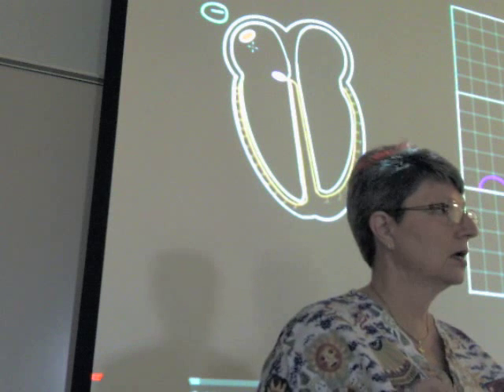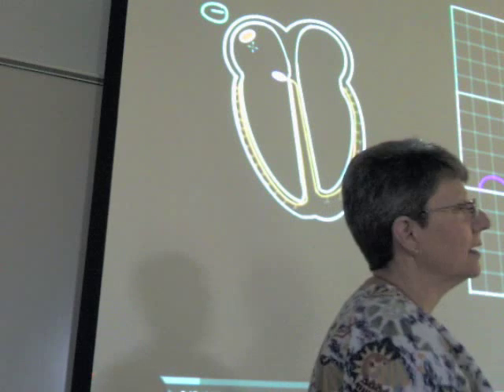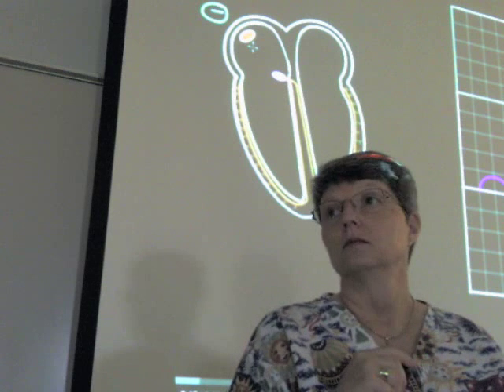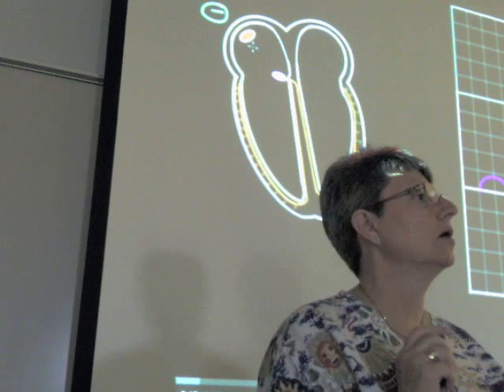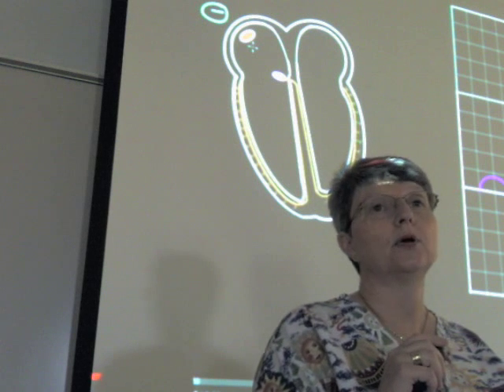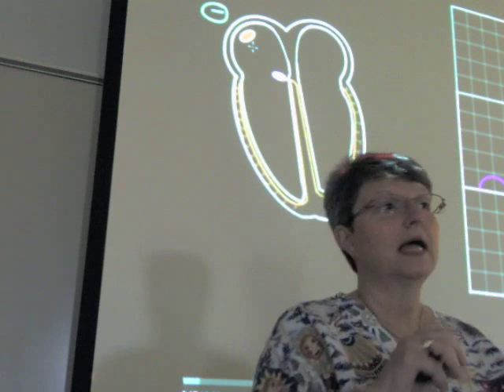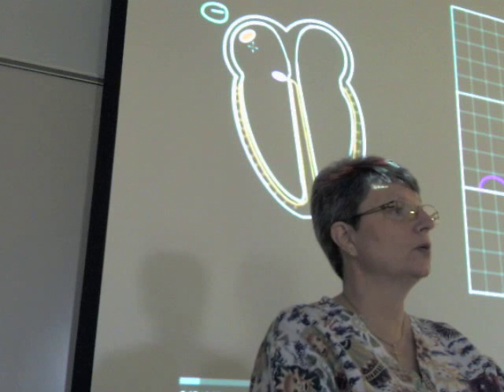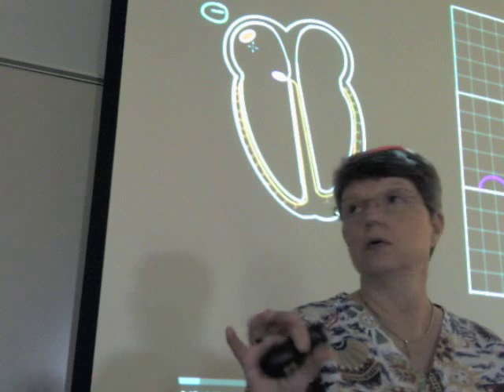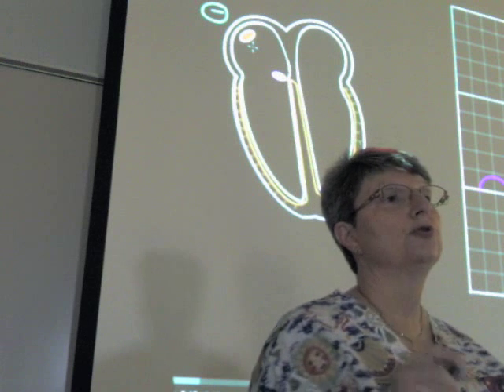And just to tell you what that is right off the bat, it is so big because it represents the depolarization of the ventricles, and that is when the impulse has left the AV node and is now moving down through the bundle branches and the Purkinje fibers to both ventricles, and it's causing the ventricles to contract.